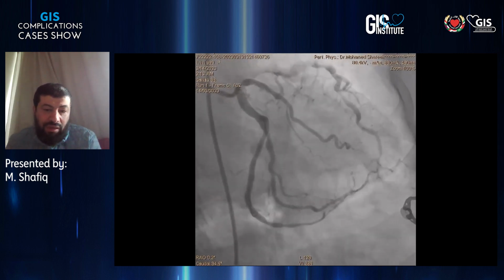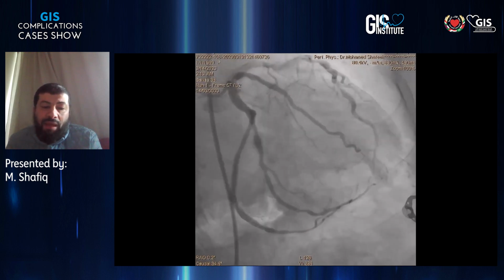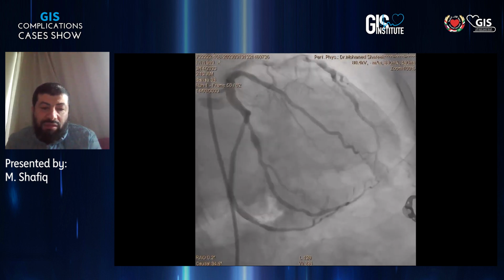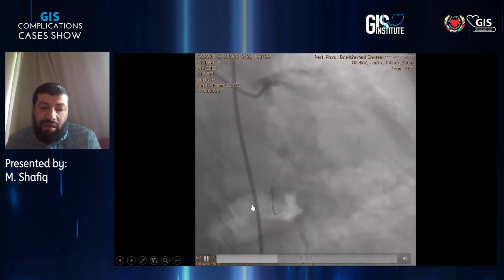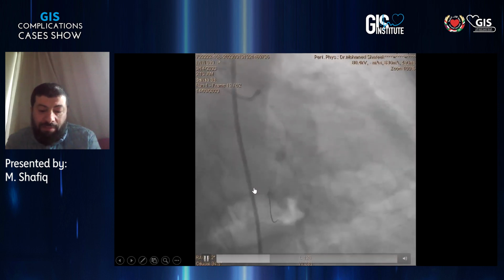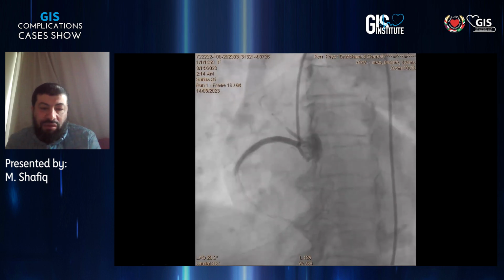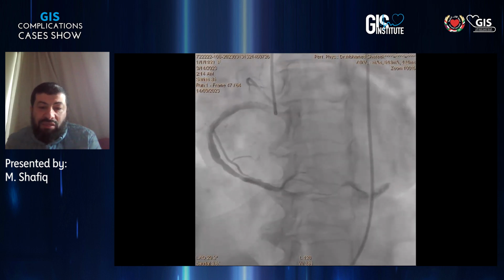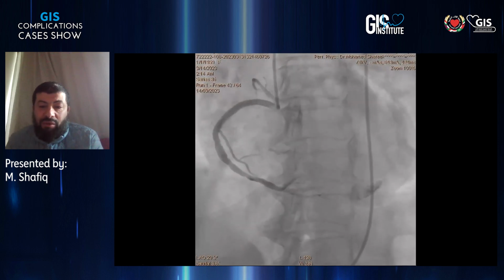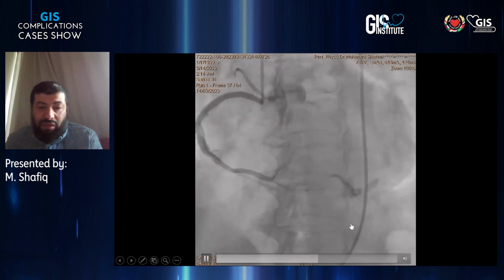What's going on? I asked my assistant to go again to angio the right coronary. You can see we were working from the right radial, but now we are working from the femoral because of spasm that happened after imaging and working in the right coronary. And this was the surprise. We didn't take note of it. We didn't notice this at all while working in the right coronary.